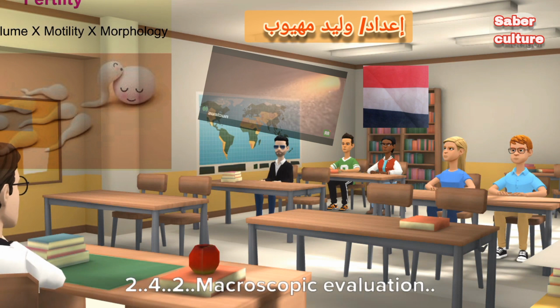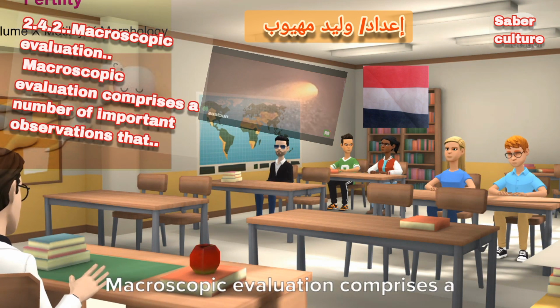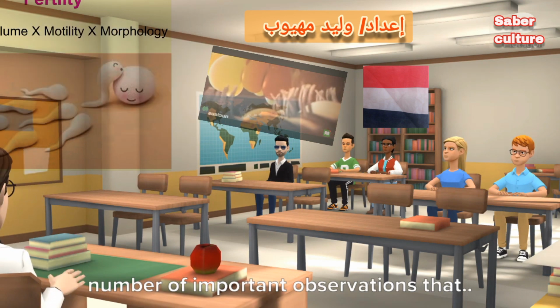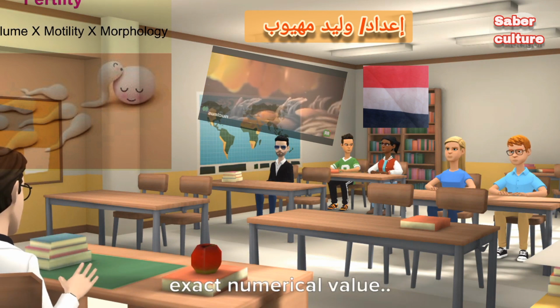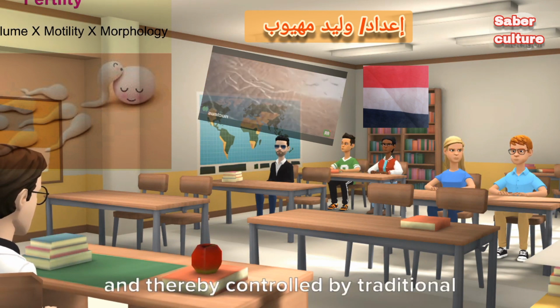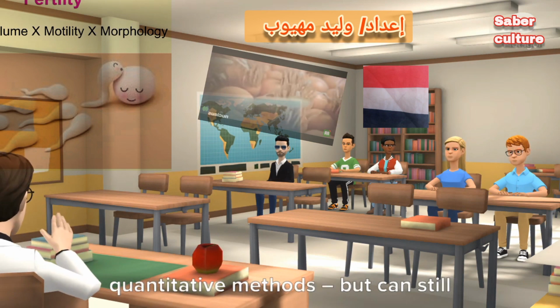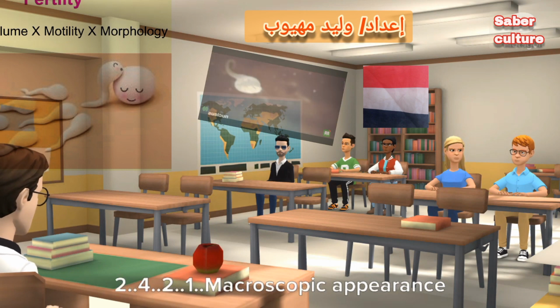2.4.2 Macroscopic evaluation. Macroscopic evaluation comprises a number of important observations that may not be possible to assess in an exact numerical value, and thereby controlled by traditional quantitative methods, but can still be of great clinical importance.